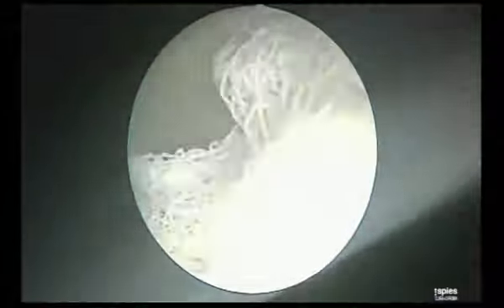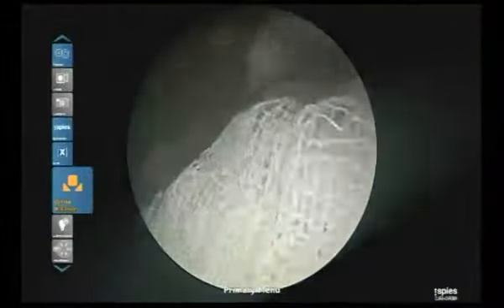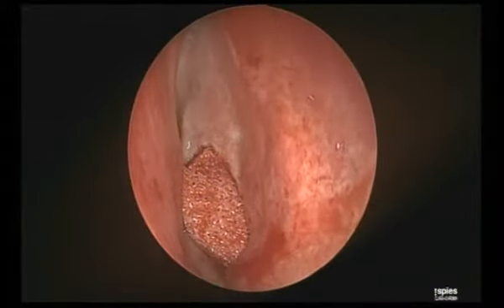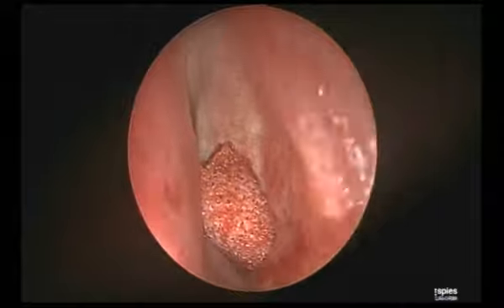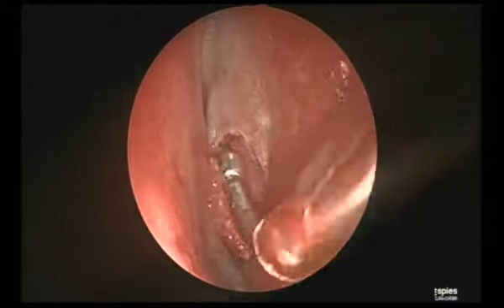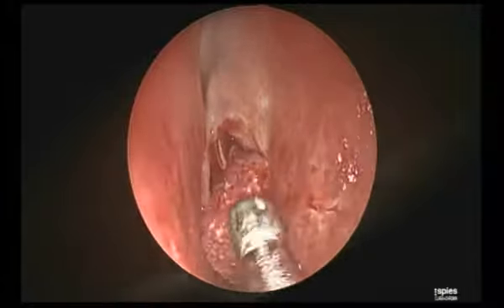Just to help you with the time audit, we have 15 minutes. You have a lot of time, but I'm just telling you in terms of milestones. 15 minutes into the surgery, I will finish off the other side in 10 minutes. Don't worry, so we can demonstrate properly on one side. We have both the options.